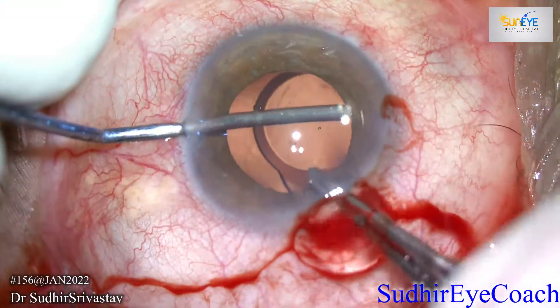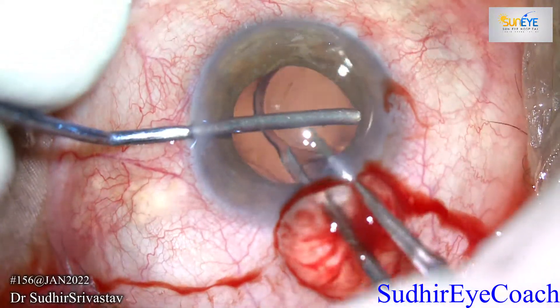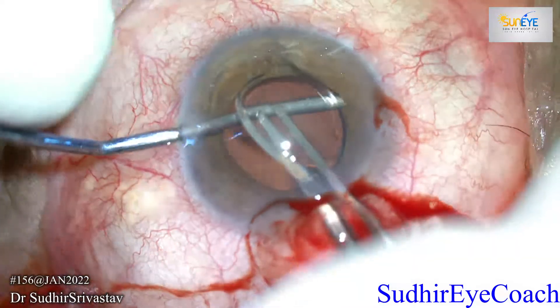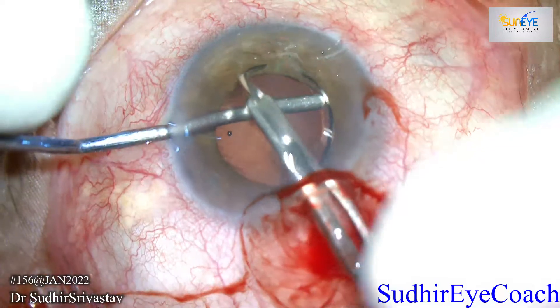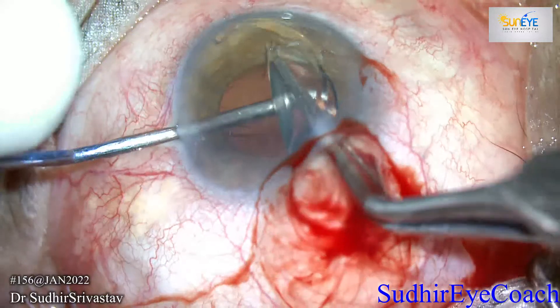I filled the anterior chamber with viscoelastic to protect the endothelium, and I placed an iris repositor behind the IOL to protect the posterior capsule. I held the IOL optic with the McPherson forceps and rotated the IOL against the iris repositor, which was placed behind it with firm pressure.